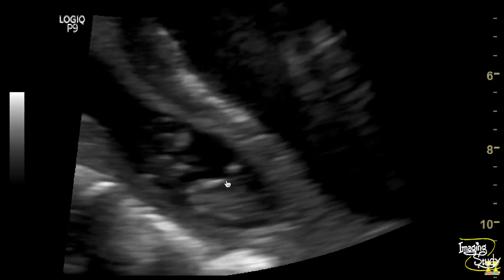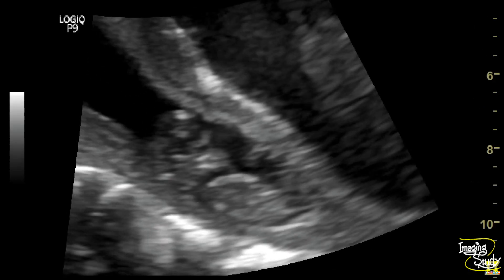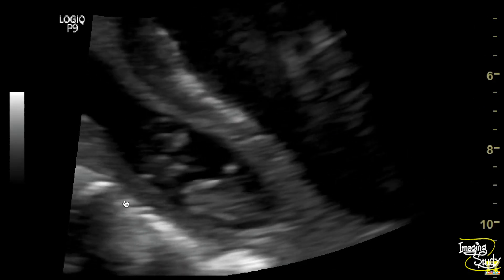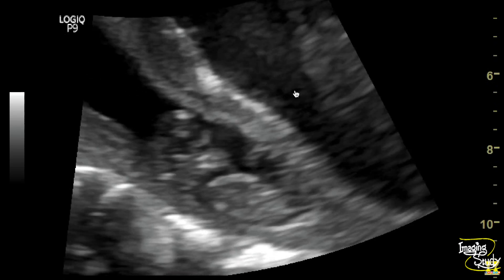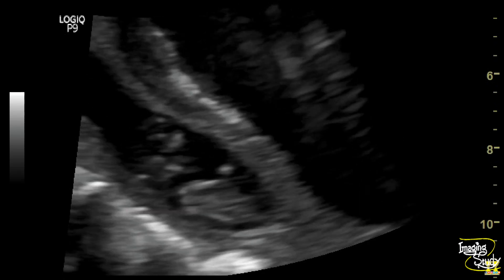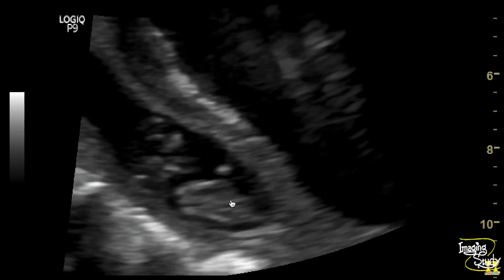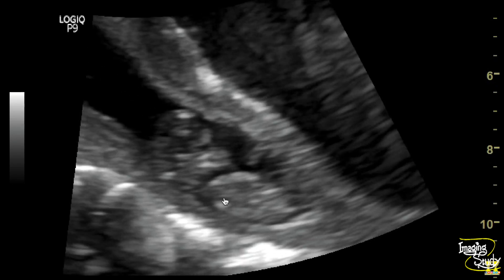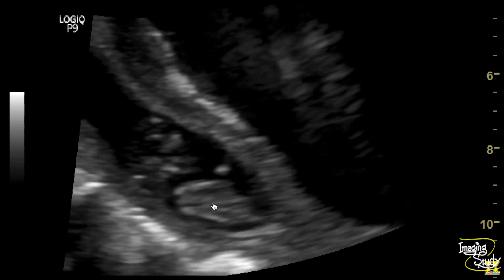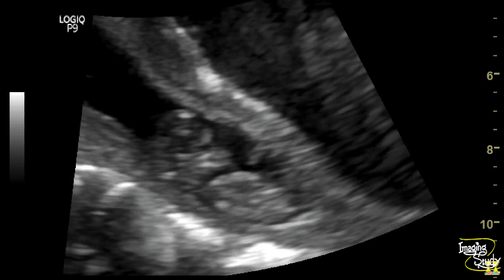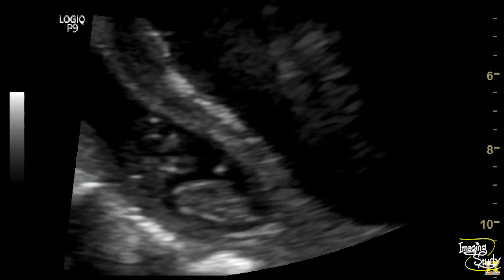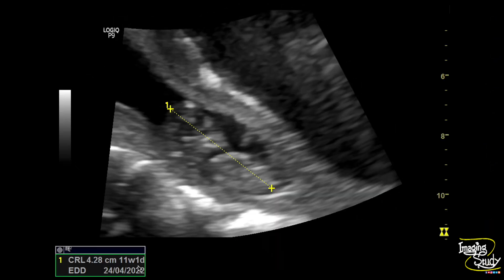Here's the magnified image and you can see the fetus within the cervical cavity with the dilatation of the internal os of the cervix. You can see the fetal cardiac pulsation. The crown-rump length measures around 42 mm, which corresponds to 11 weeks and one day of gestation.